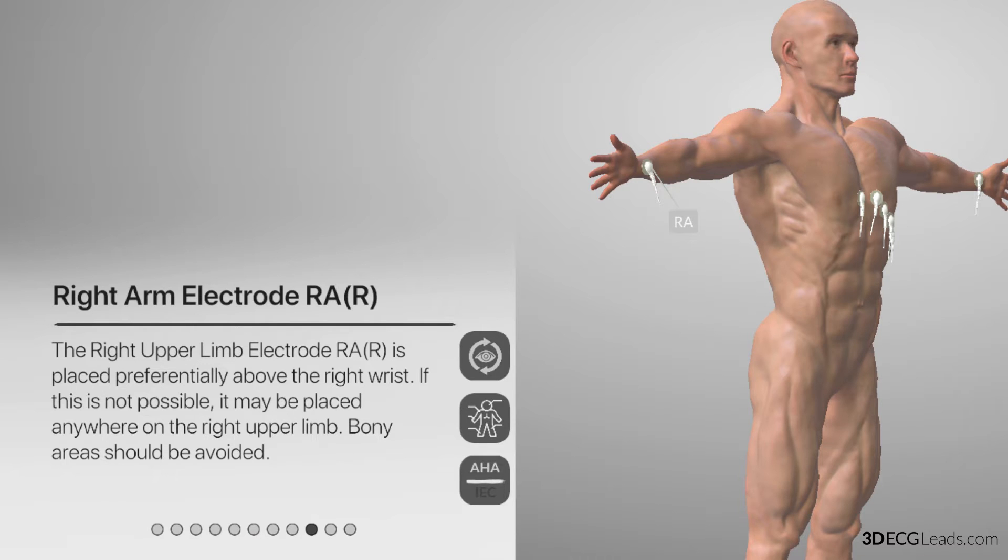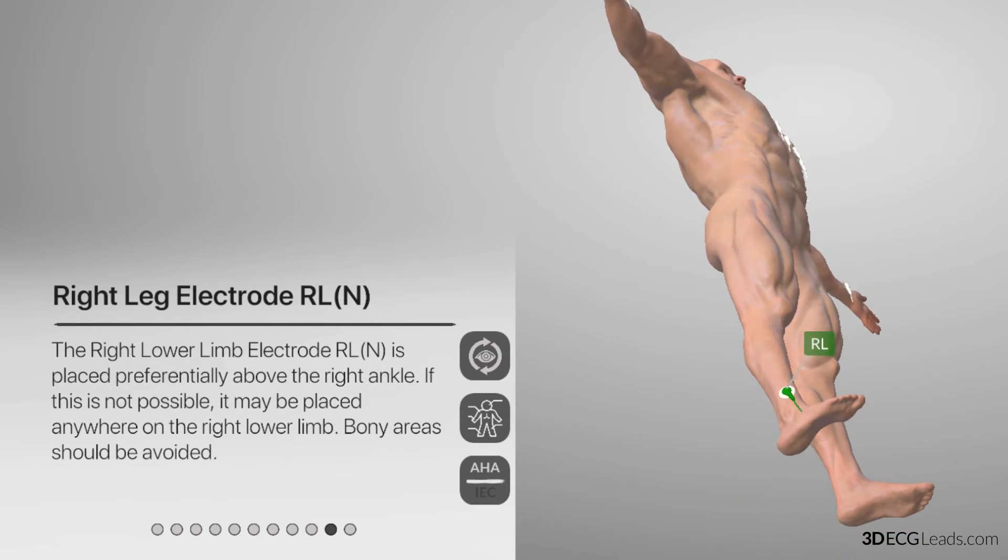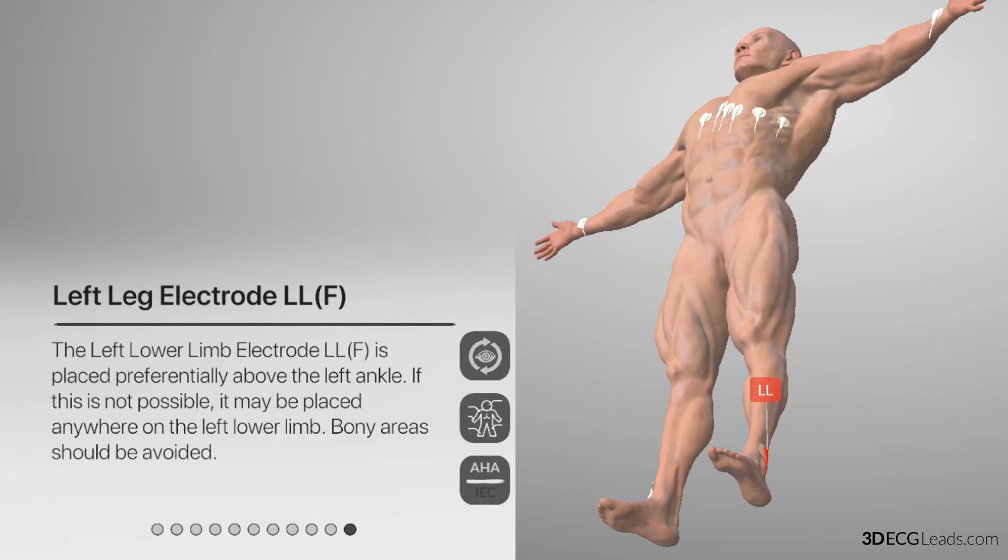Moving down to the right leg lead, it is green, and is named RL, and is placed slightly above the right ankle. And lastly, the left leg lead is red in color, and is named LL, and placed slightly above the left ankle.